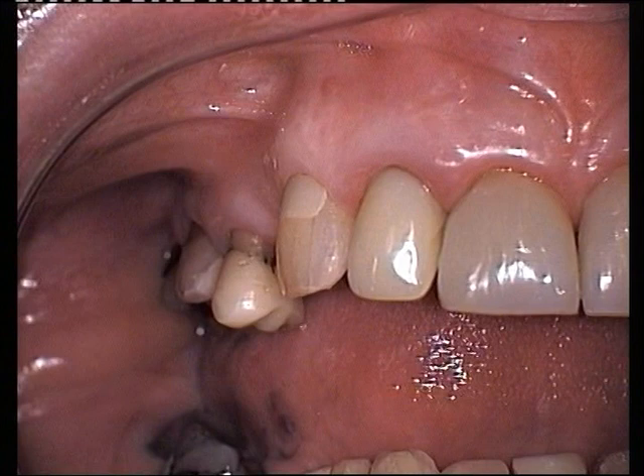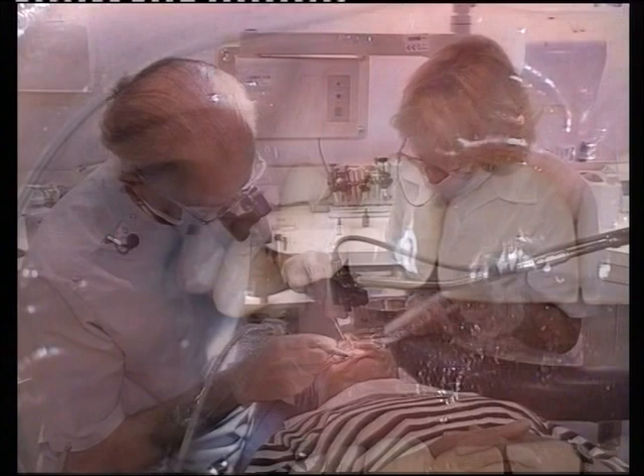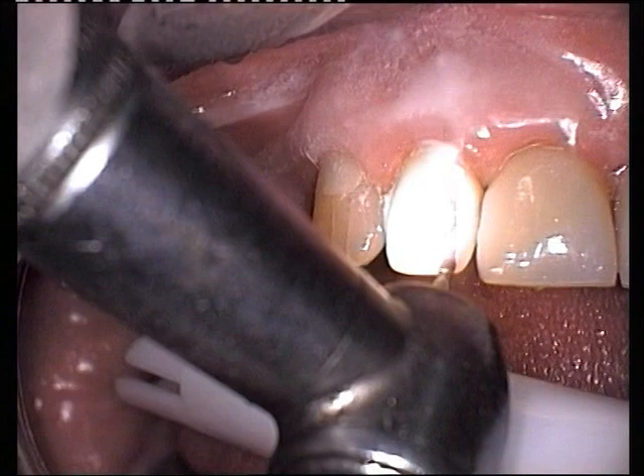This patient has a leaking resin crown on her upper right lateral incisor. The existing crown is removed by cutting longitudinal grooves with a high-speed burr, keeping away from the proximal margins to prevent damaging adjacent teeth.